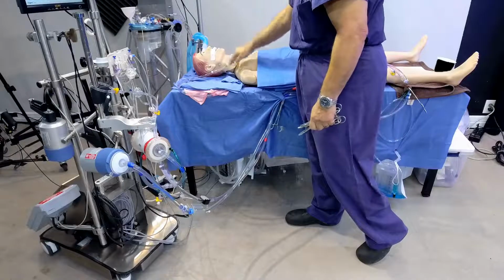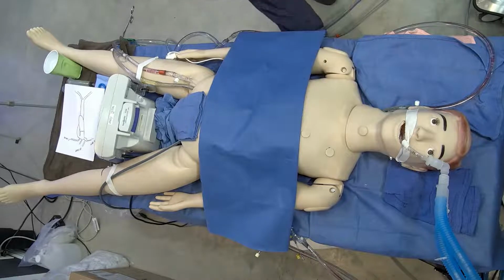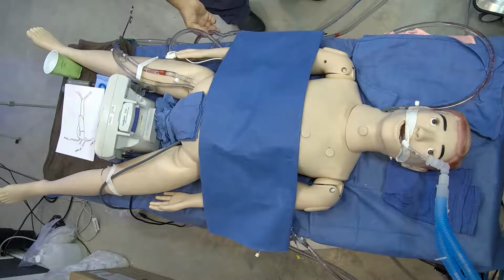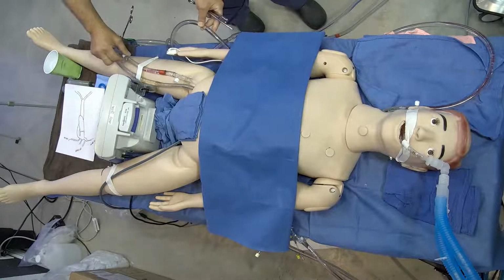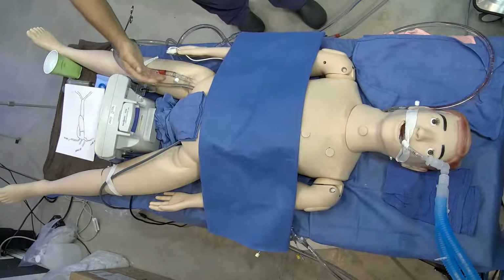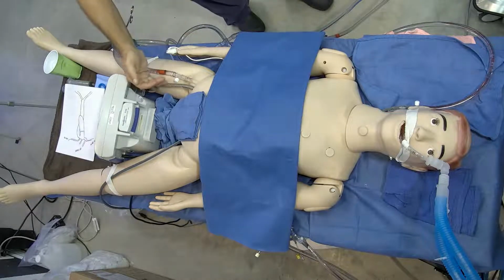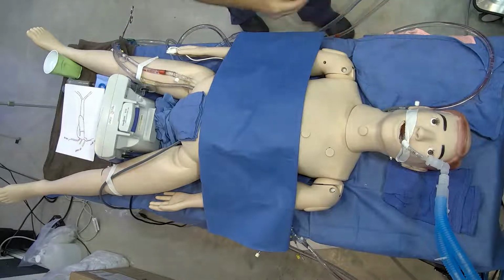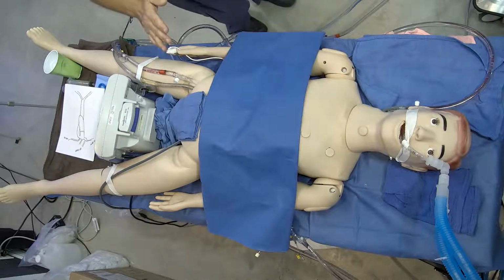So let's go back to the overview. I think that's a little bit better, yeah. So here's our Y connector. I think I can see that a little bit better. Right here. Here's our line going to the head, here to the right IJ, and here's our line here. So we have veno to the oxygenator, then arterio, venous. Venous, arterial, venous ECMO. That's what it looks like.